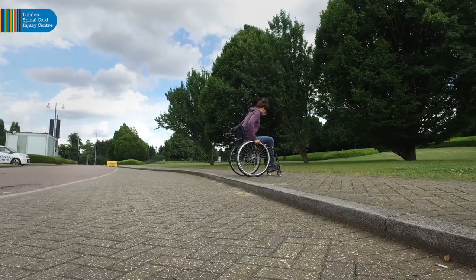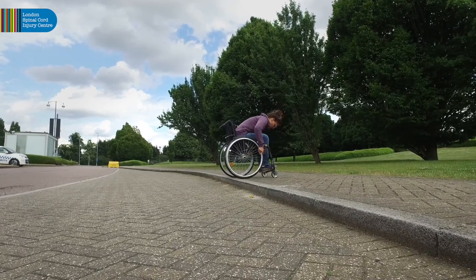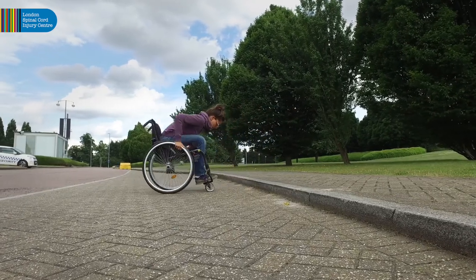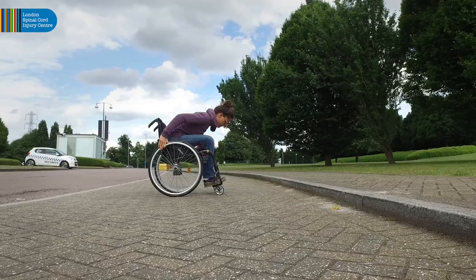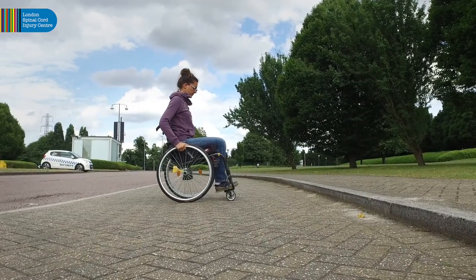If descending backwards, back up to the kerb, lean forward onto your lap, then roll the wheelchair evenly off the kerb and continue until the smaller front casters are off the kerb. Only when all four wheels are down and the wheelchair is stationary should you sit up.